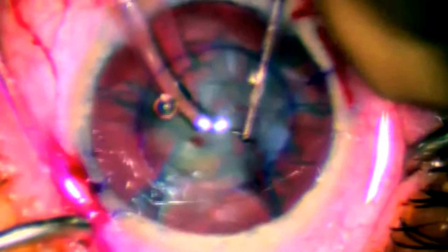This is a little bit of a softer nucleus and a little more difficult to vertical chop, but again we'll just spear the hemi nucleus with the chopper and use the two instruments to pull things apart. On a softer case like this you probably only need to chop the lens into about four pieces, sometimes a fifth piece to make it really easy to remove the first piece. For the remaining hemi nucleus, we'll slice the nucleus using the chopper and pull the two pieces apart. There's no vacuum for these subsequent chops, which makes it extremely safe — there's no worry about surge or going through the posterior capsule. Now we have five pieces and we can pull up the first piece, and you can see how easily it's removed, with the phaco system emulsifying it very quickly, making this a very efficient procedure.